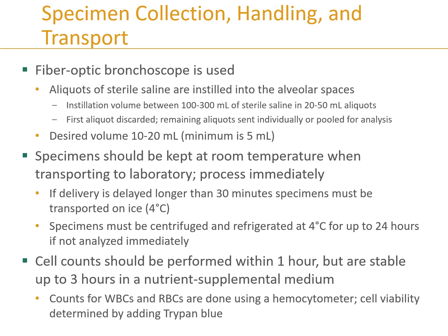Now, those specimens should be kept at room temperature when being transported to the lab, and of course should be processed immediately. Typically these situations happen in a hospital clinical setting in which these samples can be looked at pretty quickly. If the delivery is going to take longer than 30 minutes to get to the lab to be evaluated, then it should be transported on ice to keep those cooler refrigerated temperatures.